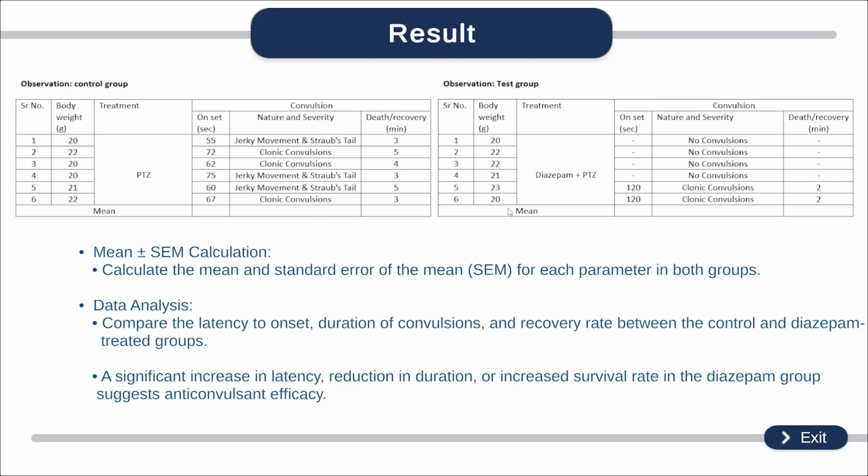It slows the abnormal and excessive nerve activity and reduces the convulsions. The convulsion causes anxiety in the animals and panic attacks, but diazepam acts against it and shortens it with its treatment.